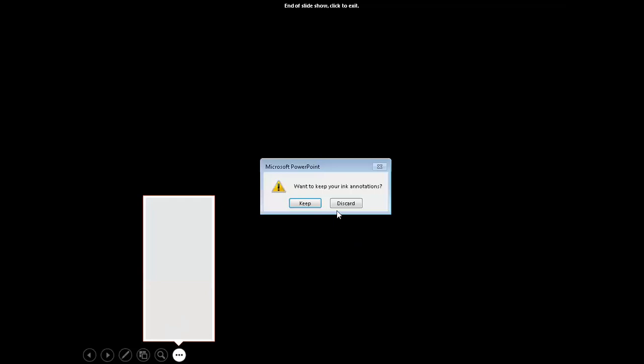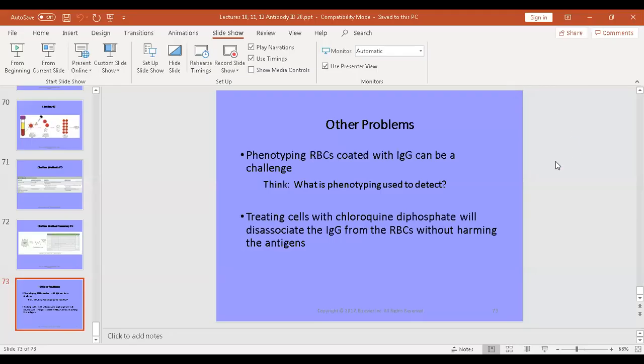And that does it for this unit. So this is very, very important stuff. I know it tends to be a little bit confusing. Please review it, and in the next lecture we're going to go through some more panel examples. It's really important that you all understand how to go through the rule out method and eliminate things and match the pattern. So please make sure you understand that, and then in the next unit we will do some examples, and I'm going to be assigning you guys some panels to do as well for practice.